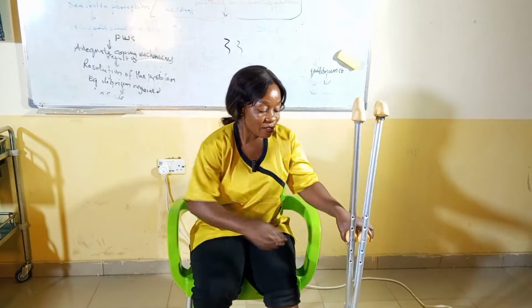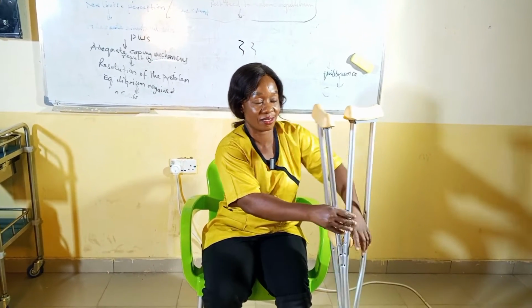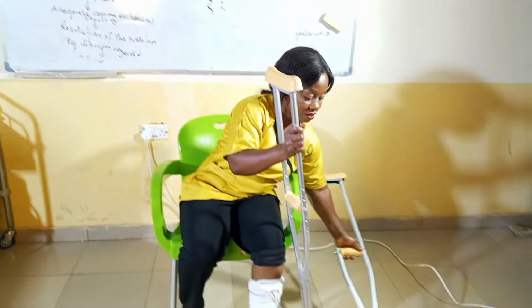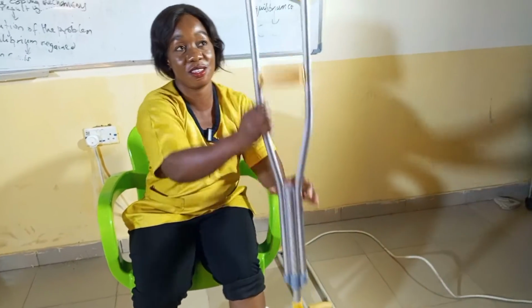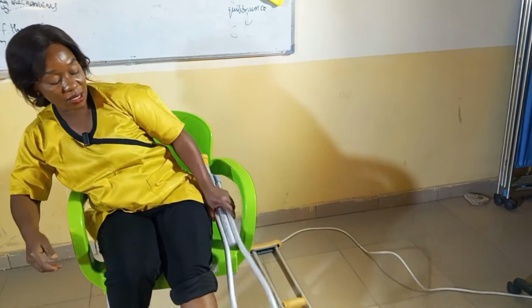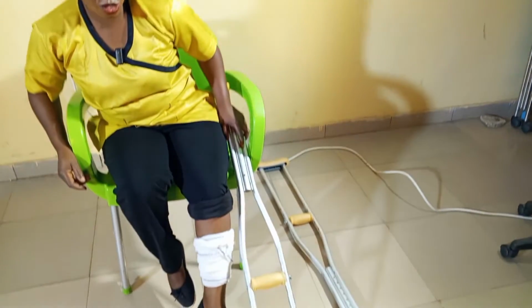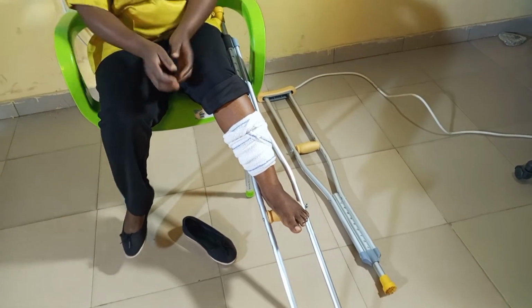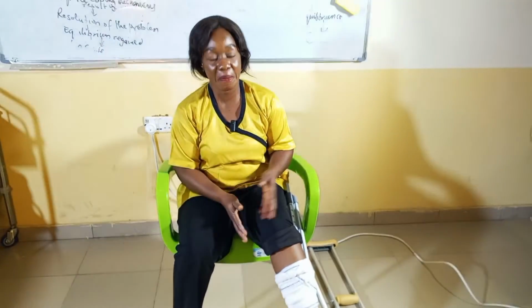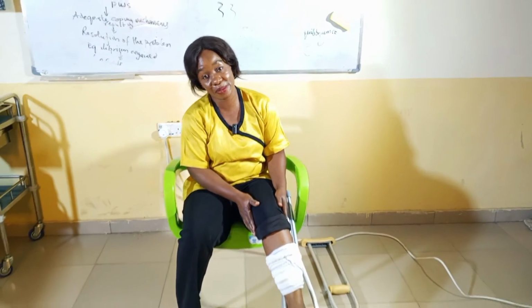The next thing is for you to put the other crutch down flat, and remember it's no weight. Then you turn this way and place it on the chair, and then you support your leg on the crutch this way, right? Because you are supporting the affected limb.